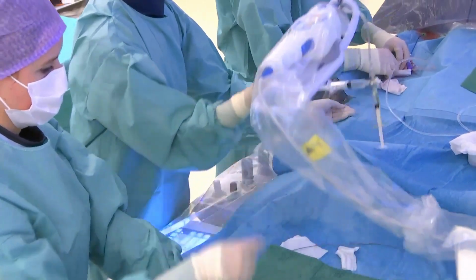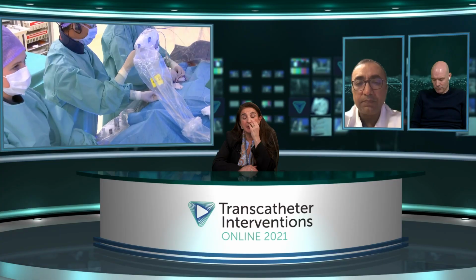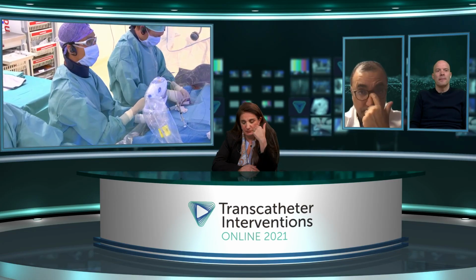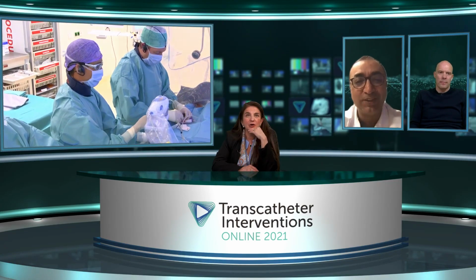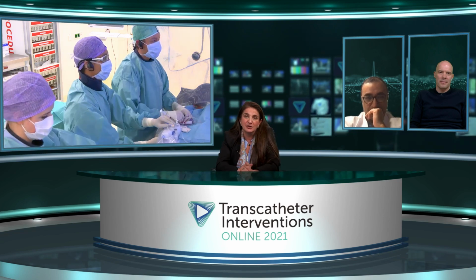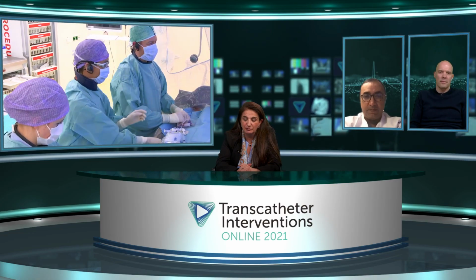So Roxana, what is the benefit of this higher speed? Sorry, Roxana, go ahead. Well, no, that's okay. We've done a lot of this at our institution. We have probably used more atherectomy than anyone in the U.S. Pretty much regularly. And what we have seen with the higher speed is, especially in the larger vessel, better ablation of the calcium and getting a better luminal diameter.